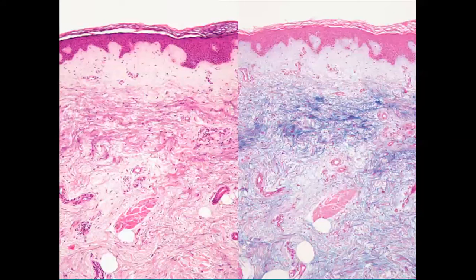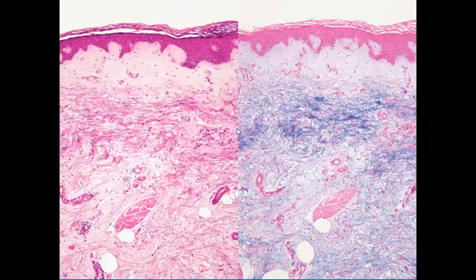In the image shown, two stains are compared. On the left is H&E stain, showing violaceous or dark pink fibers in the mid-dermis. On the right, Alcian blue stain colors these fibers blue, confirming mucinosis. While there are many causes of mucinosis, here we are seeing generalized lichen myxedematosus.